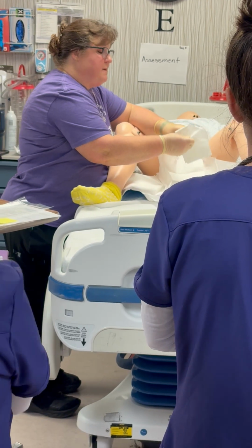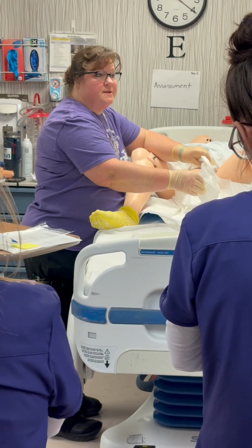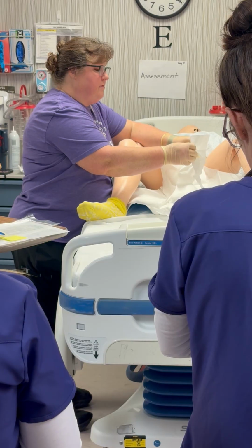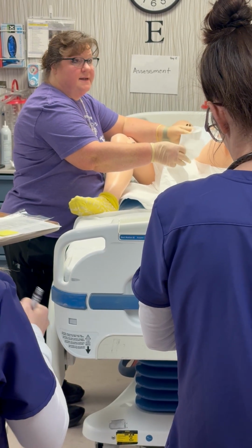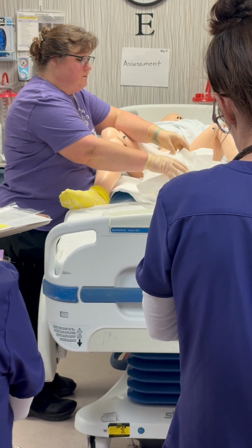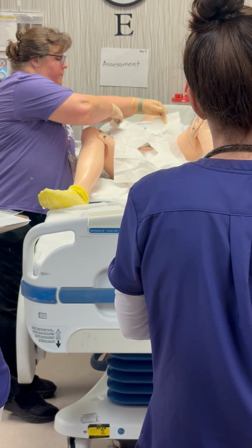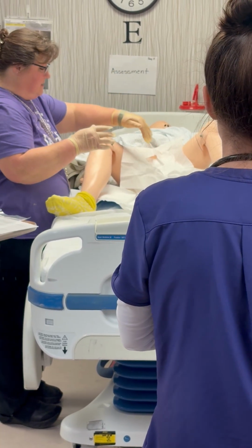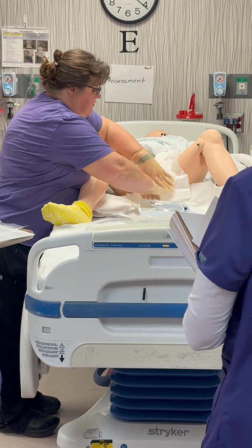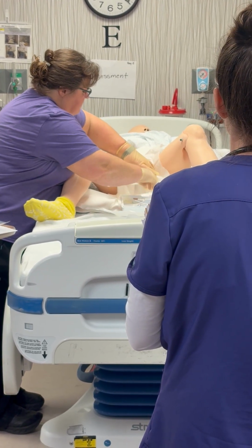The next thing down is my fenestrated sheet. It just means that there's a hole in the middle. Fenestrated means a hole in the middle, okay? If there's a shiny side, you put the shiny side down. I have not yet seen a shiny side on these, but if there's shiny, you'll put that down. Remember, I'm still going to back this in and it goes up and over the top. Okay, we'll fix this in a minute, because now I can move this, and I can touch all of this, because it's all sterile, right? And get this all where I need it to be. Okay?